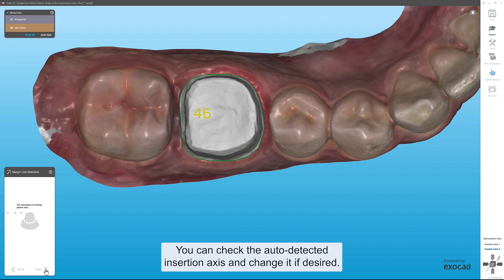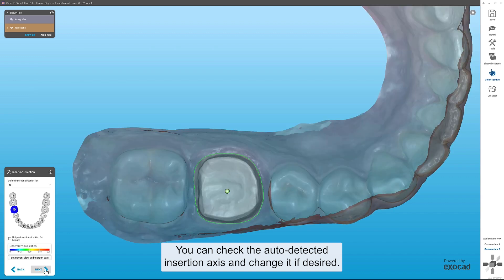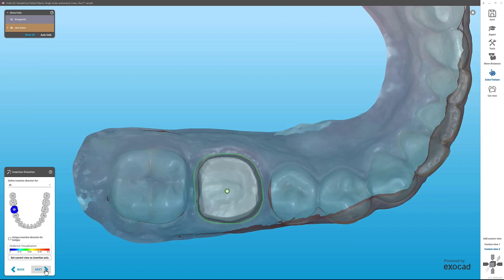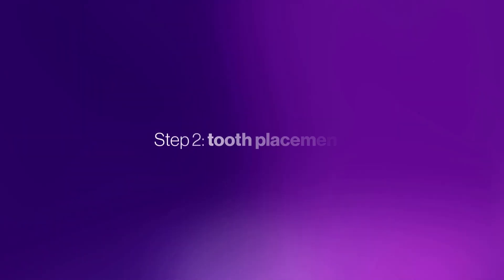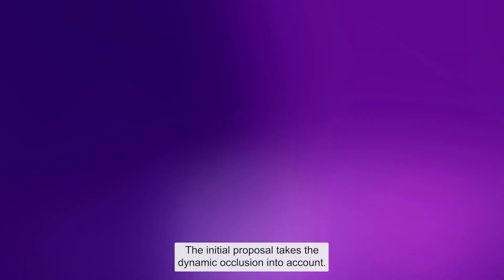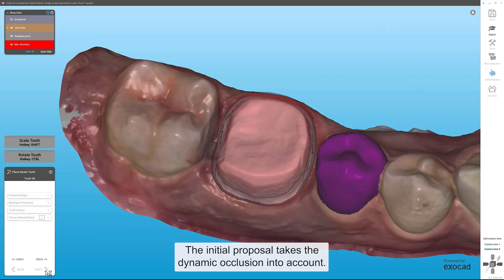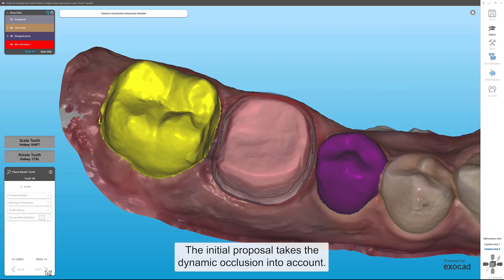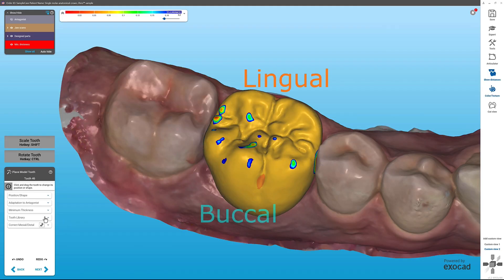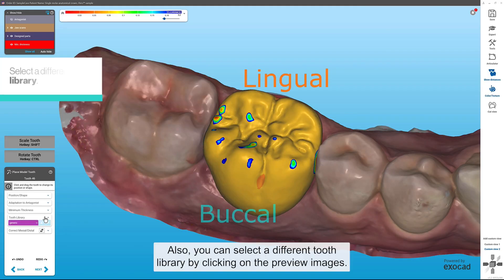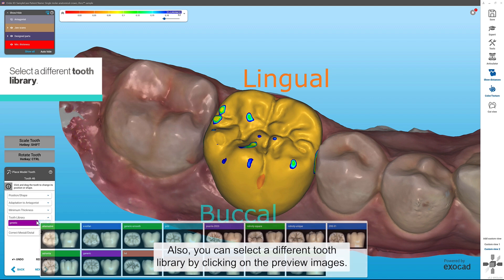You can check the auto-detected insertion axis and change it if desired. The initial proposal takes the dynamic occlusion into account. Also, you can select a different tooth library by clicking on the preview images.